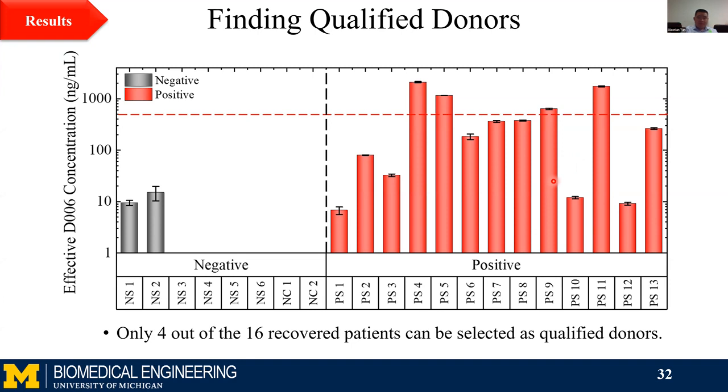And then if we identify some strong donors or super donors, we can do, for example, neutralization potential evaluation of their serum. So we do not need to do neutralization evaluation for all donors. This will definitely speed up the turnaround time of finding qualified donors in the convalescent serum therapy, and definitely will give some help to the throughput of the convalescent serum therapy.